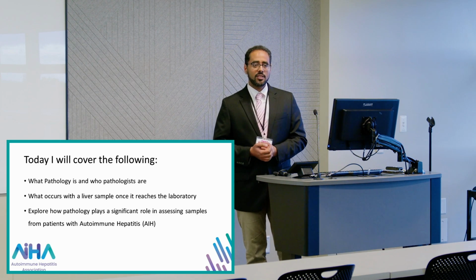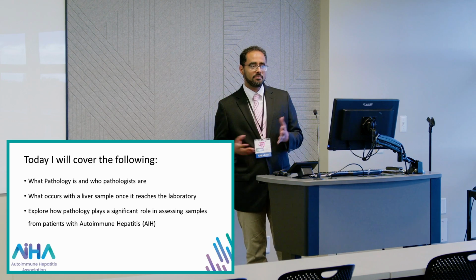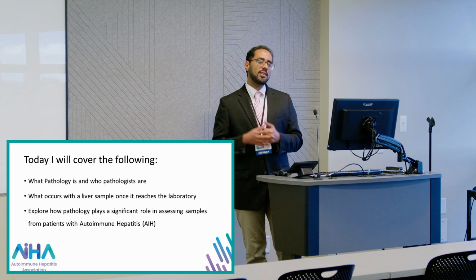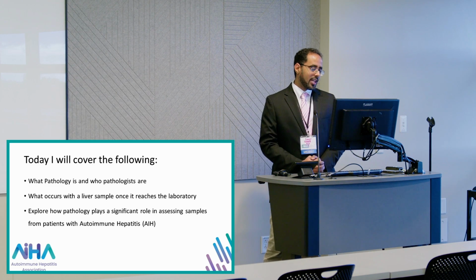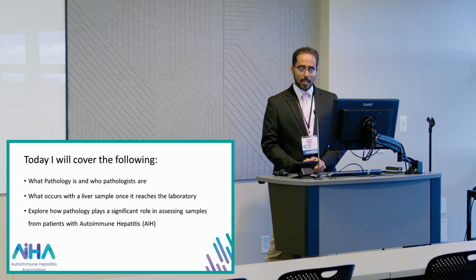sometimes it takes 2 days, 3 days for the pathology report to come out. So it will take you on a journey through what happened to the liver biopsy. And then I'll talk about the role pathology plays in the care of autoimmune hepatitis, okay?